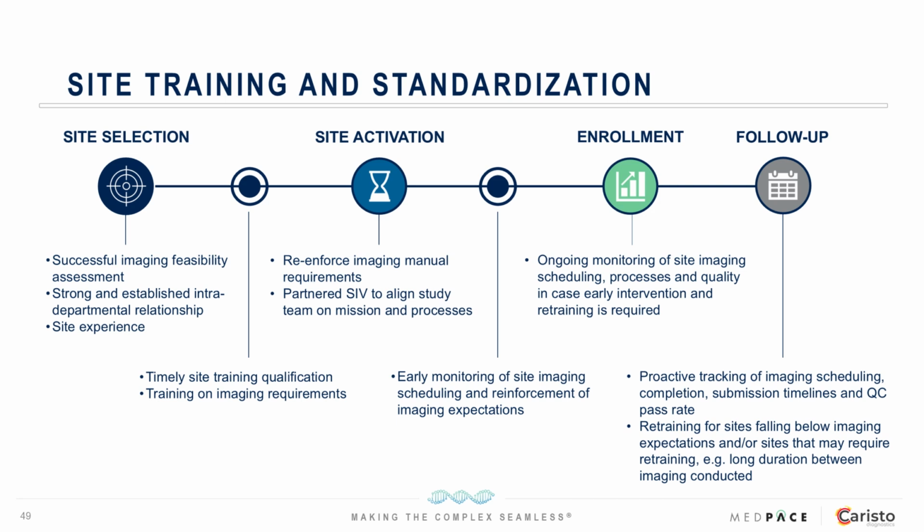Oversight and tracking of these aspects will allow the clinical trial team to assess where retraining may be required and help standardise processes and quality in a timely manner. Also, the clinical trial team should establish and monitor a set time period from initial training to performing imaging assessments, and the time frame individual assessments are being done. This allows for proactive site retraining to ensure standards are being met and quality is maintained.